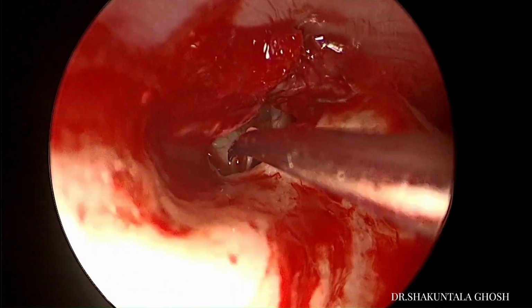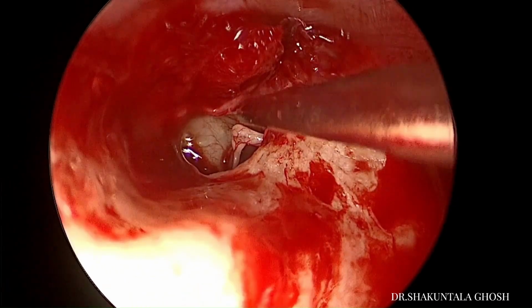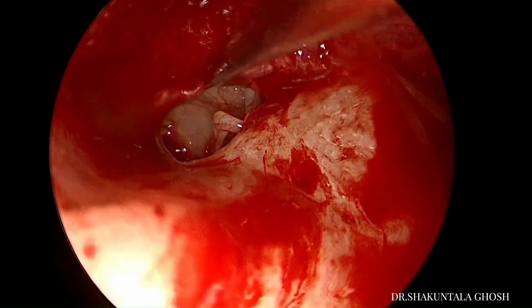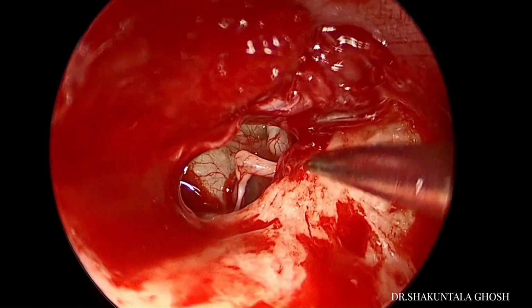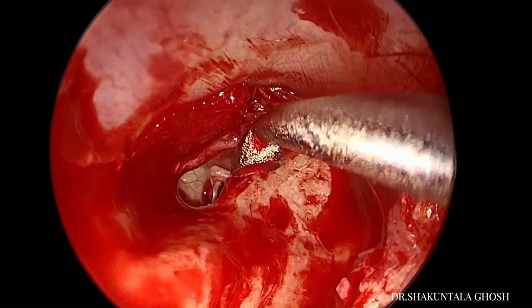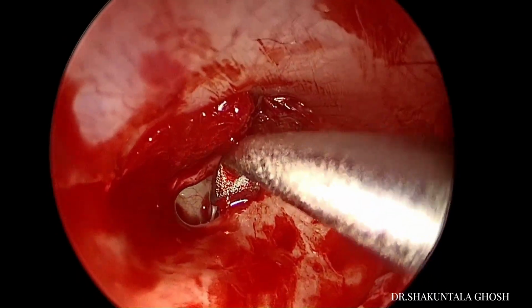And now I am palpating the malleus handle to see the mobility. Incus is mobile but stapes appears to be fixed. So the malleus handle is not in view, but I can palpate it with the curved pick. And when I am doing that I am seeing the movement of the incus.